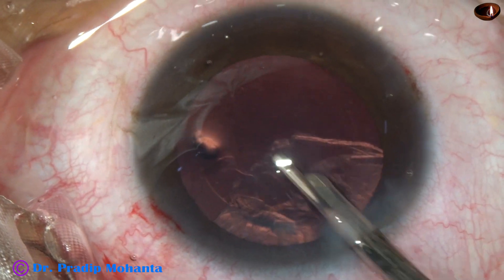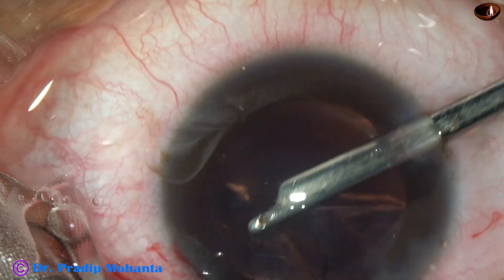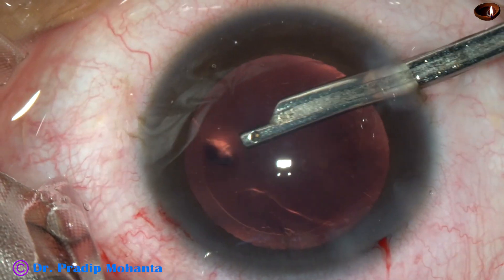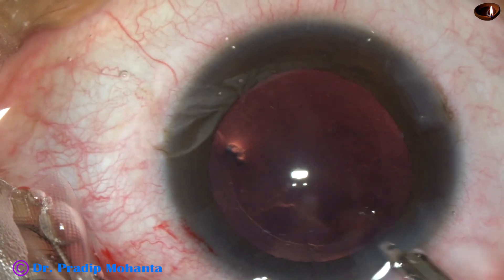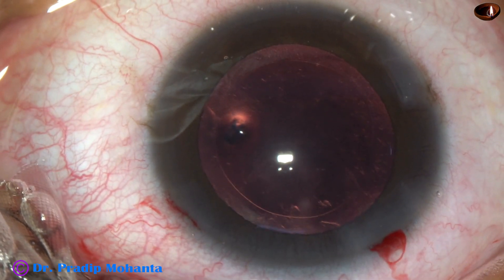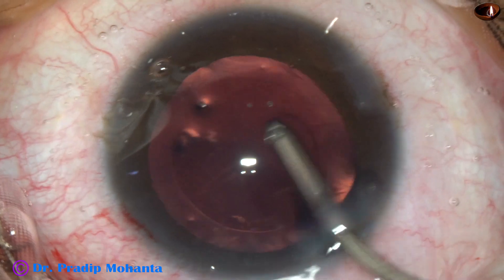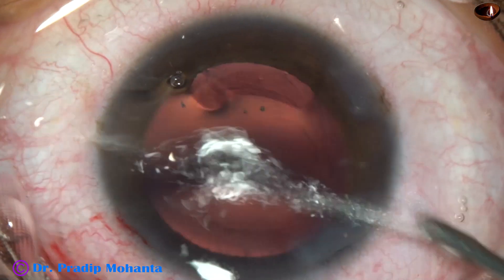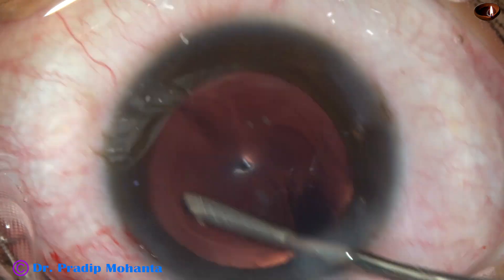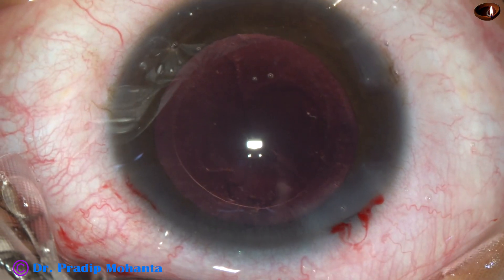A large dose of BSS is poisonous to the cornea. Even water in a huge dose is poisonous. If we work in the anterior chamber and a lot of fluid movement occurs in the anterior chamber for a longer time, this is not good for corneal endothelium. So we should finish off the surgery as quickly as possible — but meticulously, we must give adequate time. Unnecessarily, we must not spend a lot of time in the anterior chamber.